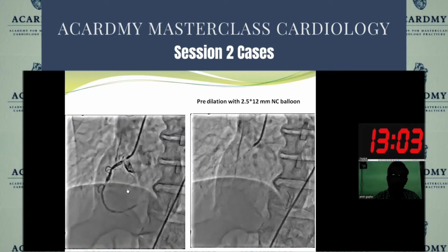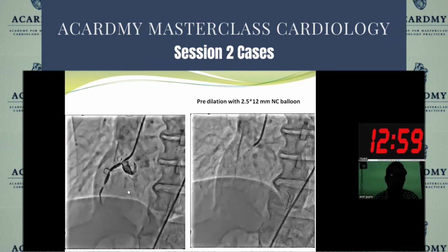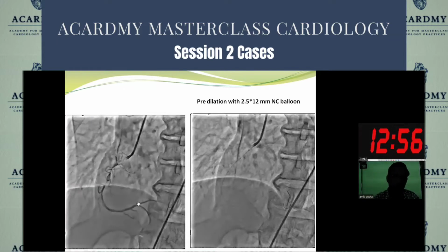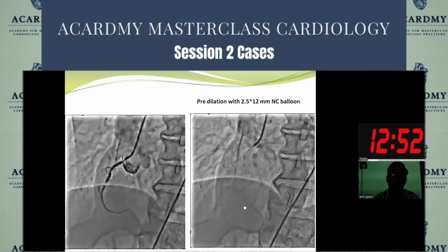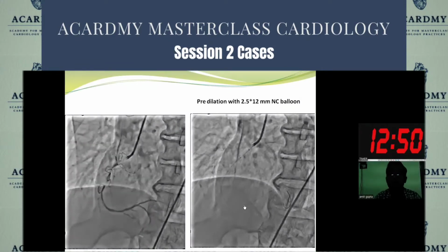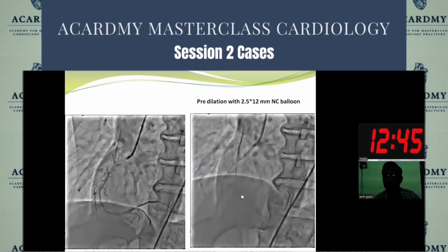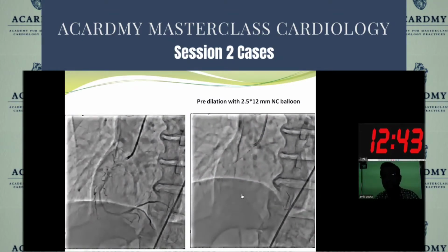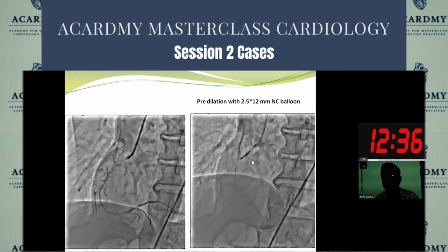We have given nitroglycerin to the RCA, but the lesion remained the same. So now we have to deal with two lesions: one is the ostial tight lesion, and the second is the thrombotic lesion in the mid RCA. First I thought there might be a difficulty in taking the stent directly to the mid RCA, so I decided to pre-dilate the ostial lesion with a 2.5 by 12 NC balloon, so that it would be easier for me to take the hardware into the mid lesion.